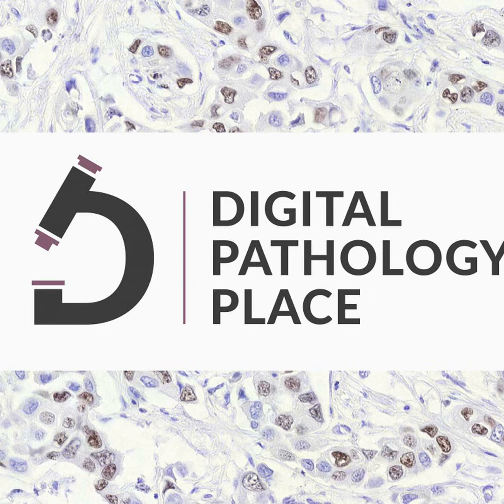Yeah, I think AI is really impacting all aspects of quantitative analysis. We see the value of AI in doing slide QC, right? It's really important to make sure that we get rid of out of focus areas and all those typical artifacts we see in slide scanning systems. They're not really inherent to the slide scanning systems, but you do get some artifacts like that.